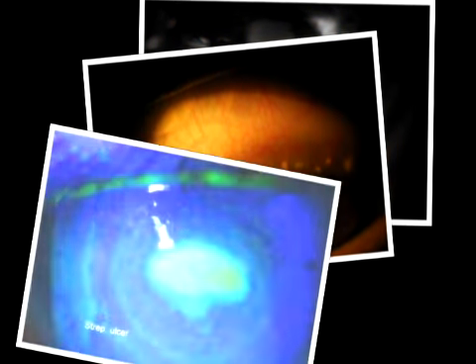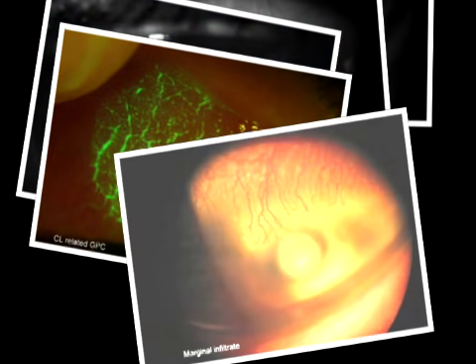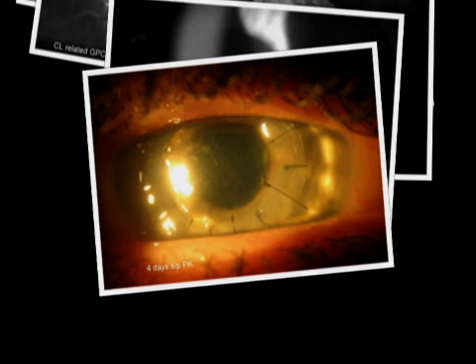There are undoubtedly other potential applications and adaptations of this versatile system throughout the ophthalmic field. It is hoped that by sharing these experiences, you've gained some insight into the potential for OculoCAM to enhance your practice and your quality of care.